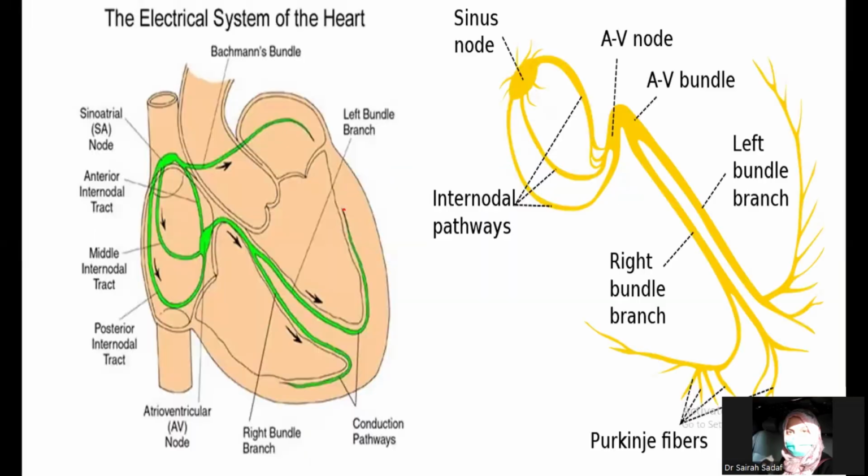Bundle branch block. Now talking about the bundle branch block, we are strictly talking about the conduction blocks. Conduction pathway, any abnormal condition related to the conduction pathway, bundle branch block. Now, just a quick repetition of what we have gone through yesterday.